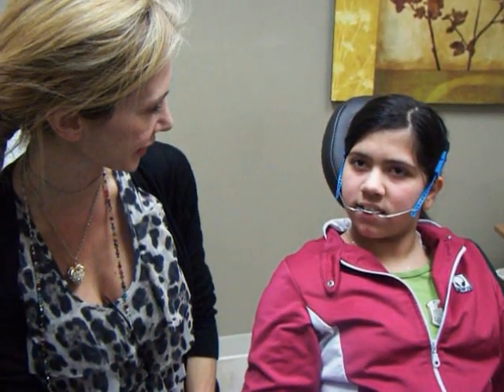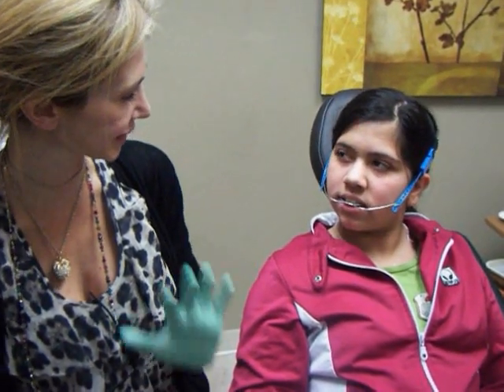Do you have any problem wearing it to bed at night? No. Do you find you have to sleep on your side? No. And does it ever come off while you sleep? Not really. And is it uncomfortable now that you're used to it? No, I've always been used to it.